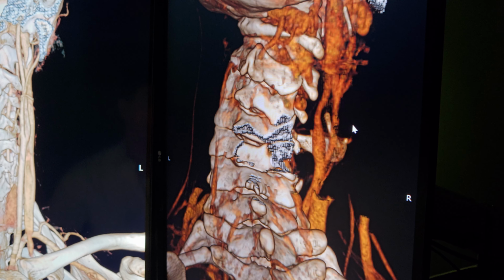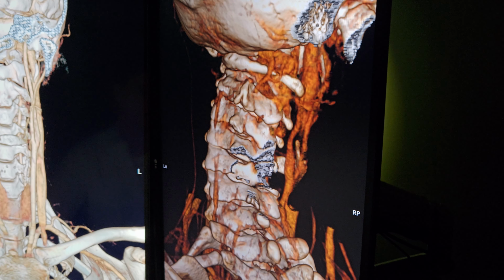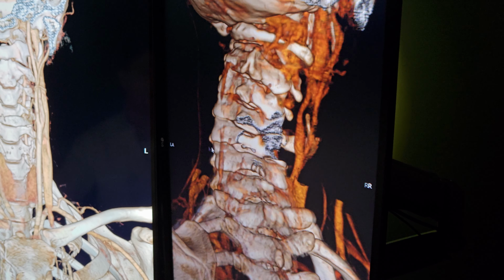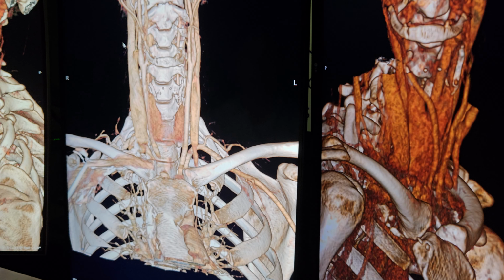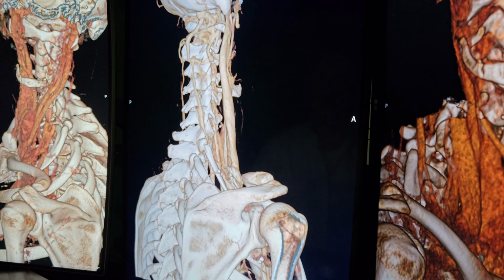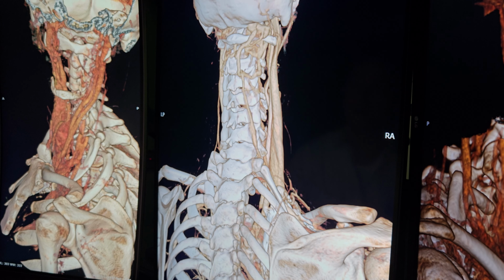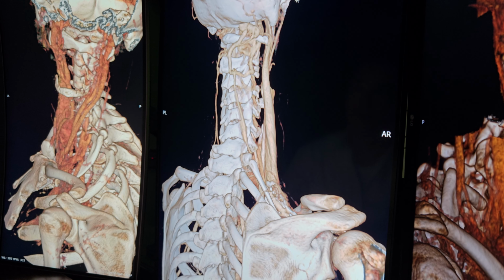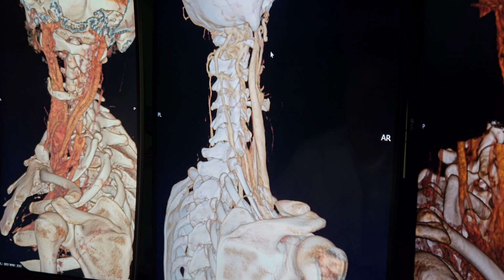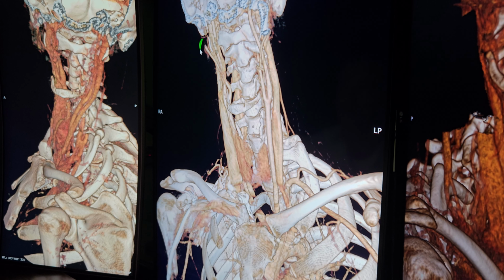All right. So that was something that jumped out at us. Look at what it's doing there. We think that's causing a lot of your symptoms. The other thing that has to be causing some symptoms is the jugular vein compression. Let me clean that up so we can see it better. You have 2 jugular veins. They need to be draining on both sides. Some doctors think one's good enough, but that is not true.